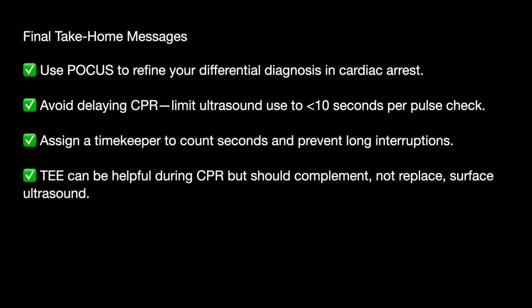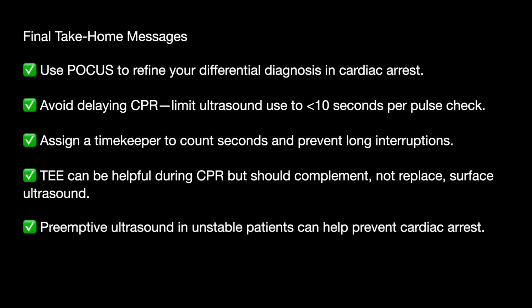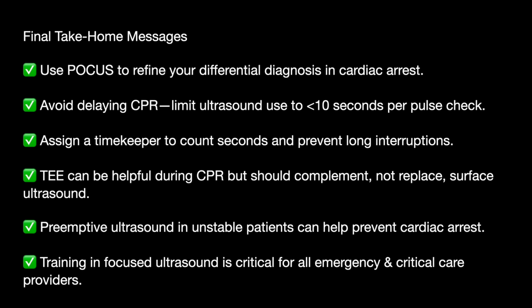TEE can be helpful if it is previously placed, but it is not a replacement for surface ultrasound. Preemptive ultrasound for unstable patients should be done so that you have a prior idea where the problem is going to be happening. Training and focusing the ultrasound in critical care for all providers is of paramount importance.